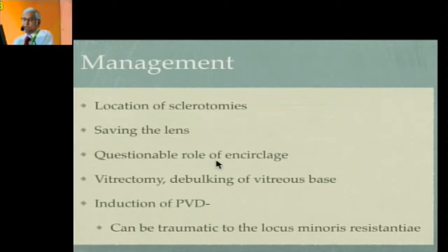Questionable role of encerclage, especially in an eye with a large coloboma extending almost through about 4 o'clock hours. What is encerclage doing? Really nothing, because the inferior part doesn't need any support. There's no retina there, and the part of the retina which needs support is all superiorly located.